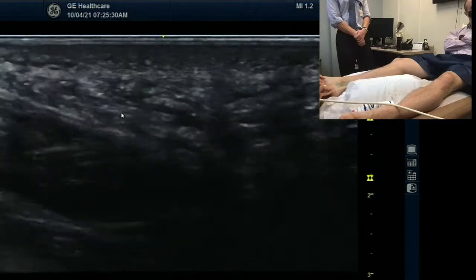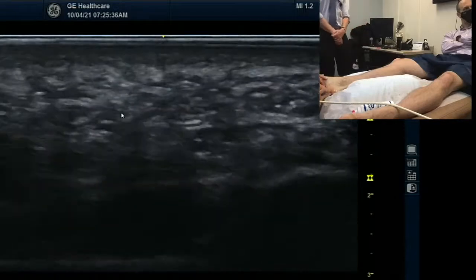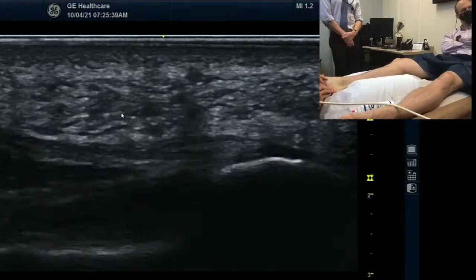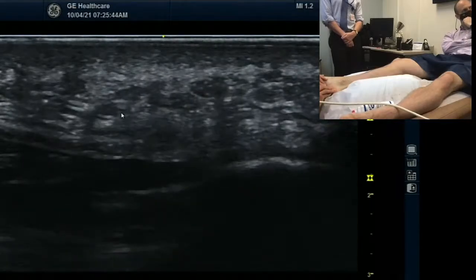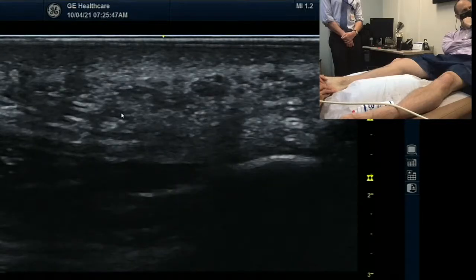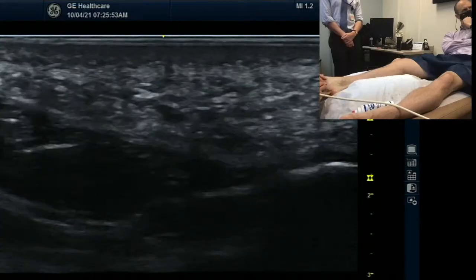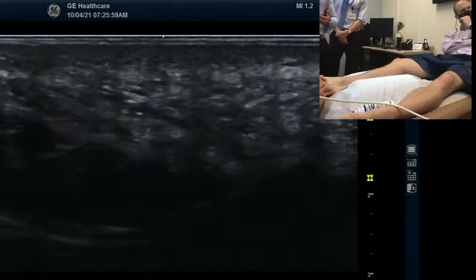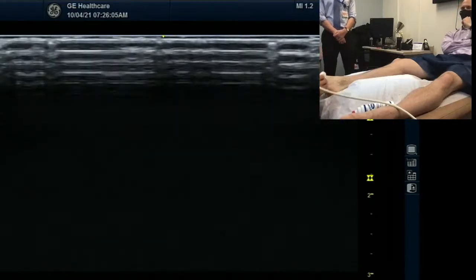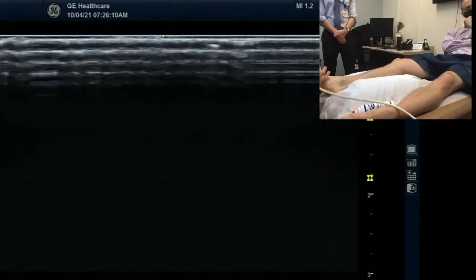Oh, beautiful. Let's see. That's the plantar fascia? Yeah. Which one is that? Underneath his fat pad. First one is fat pad. Let's try. I don't know anything about the foot — foot's interesting. Let me get a better view. Let me freeze it. Let me just get better. Try to get rid of that. Do you guys have that towel? I just want to remove some gel — for over-lubricating. All right, thank you so much.